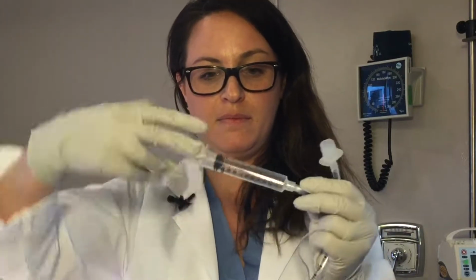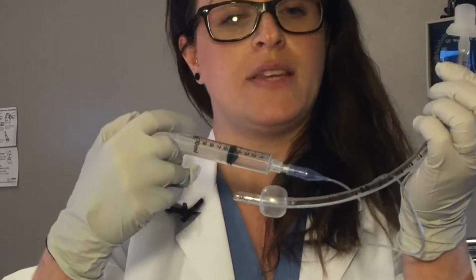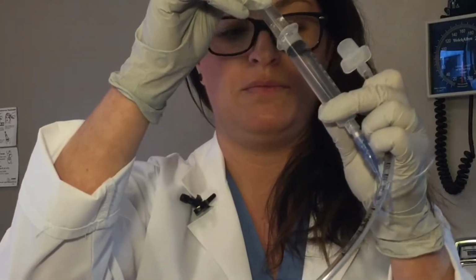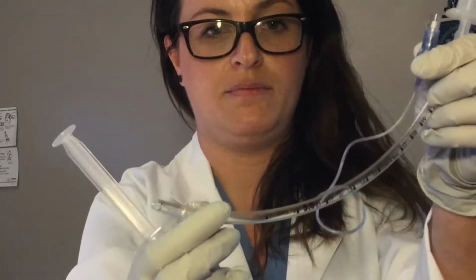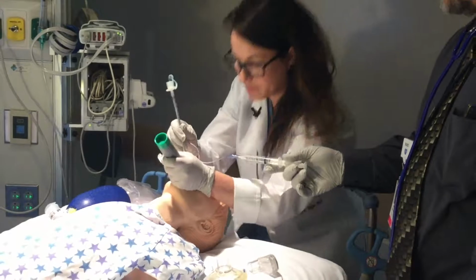When intubating with a cuffed endotracheal tube, we always make sure the cuff inflates properly. After ensuring that the cuff is inflated properly, we deflate the cuff. Intubating with a cuffed endotracheal tube is a lot like intubating with an uncuffed endotracheal tube.